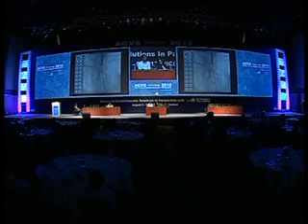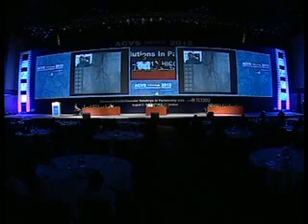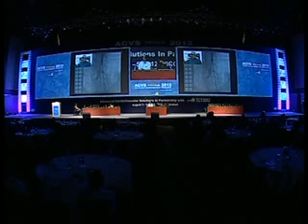So we'll go ahead with the deployment. I'll start deploying a little higher than the renal because I have the option of pulling down at a later stage. So I'll open the first two stents. Okay, so I've opened a bit of the device. Now, Sujit, can you just give me a test there? Yeah, so Sujit is testing. Now I'm in a cranial 45-degree view, AP cranial 45. I've lost contact. Yeah, I think this is fine. No? Okay, so now I can release the, I think they're not hearing me.